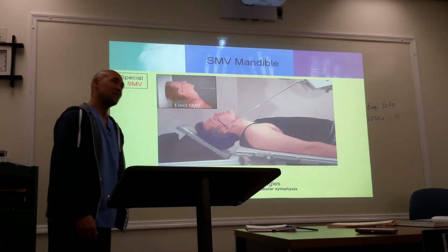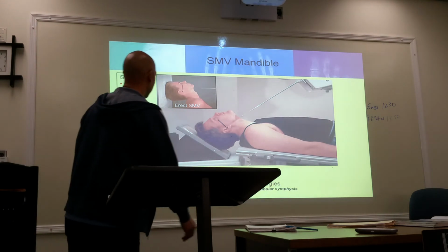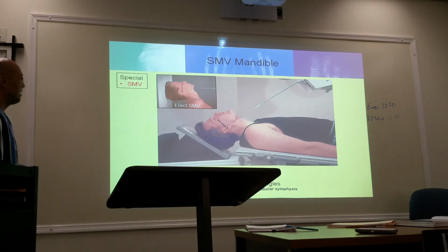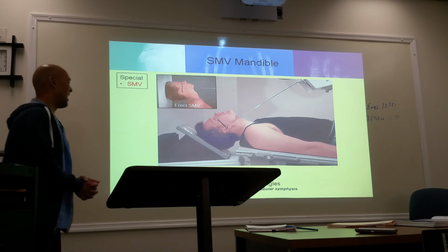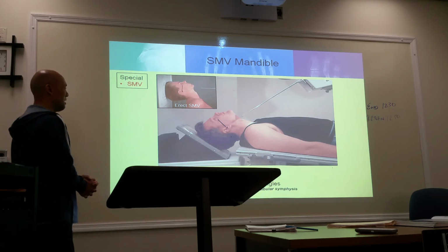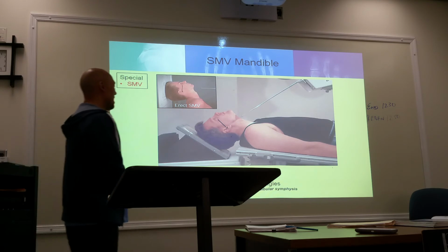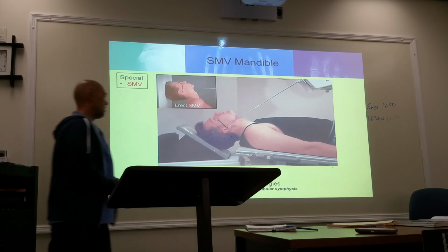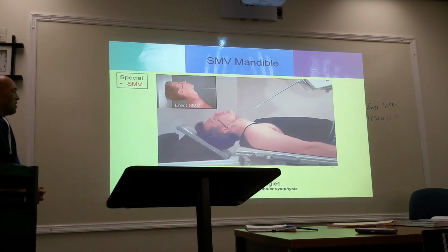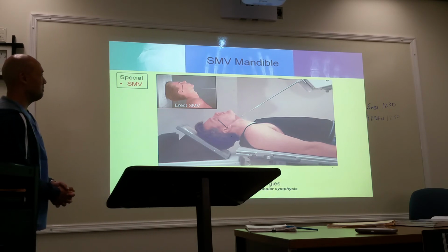Okay, SMV. SMV. IOML parallel to the image receptor, and the central ray is going to be perpendicular to that image receptor, directed 1.5 inches below the mandibular symphysis.